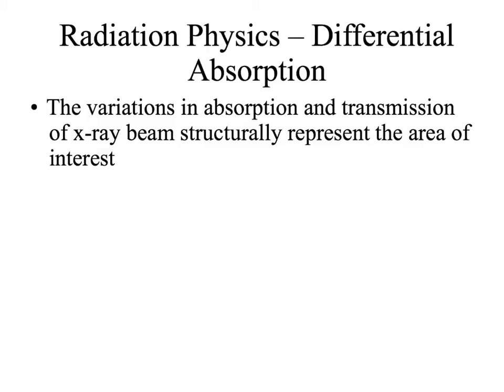Now, I know there's a whole lot of kind of nerdy language going on there. We're going to pretty much spend the rest of this class unpacking what that means, but just keep in the back of your mind that we're talking about variations of absorption of the x-rays, what are absorbed, what are transmitted, and how that can structurally represent the area of interest, which is the patient's body, right?